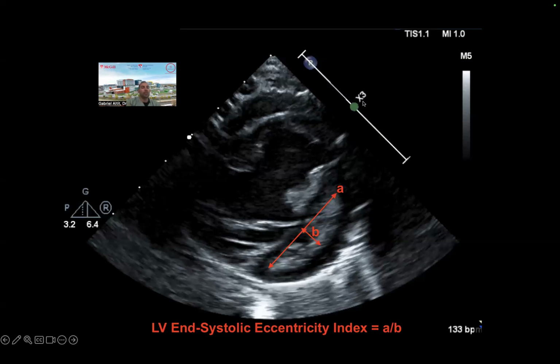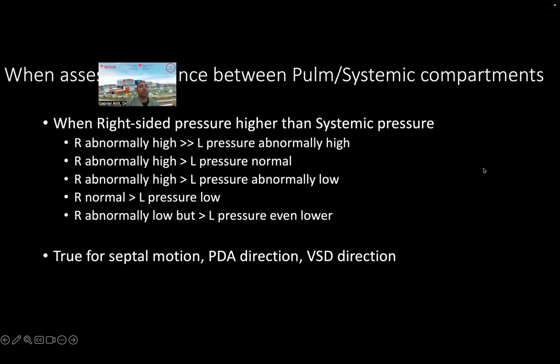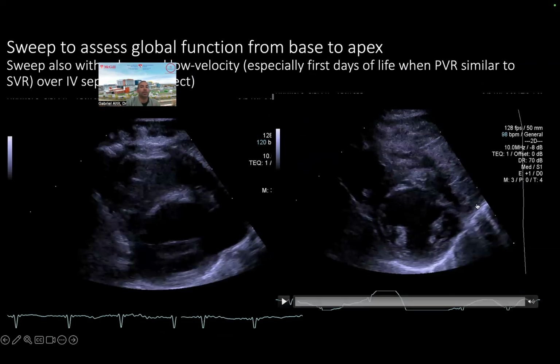And then X3 on the Philips is a type of AI algorithm to optimize the imaging. You have X-res from 1 to 5, basically, and these are different algorithms that Philips developed to tweak the images. You'll see that when you scan. So each machine differs. This, for example, is a Siemens.